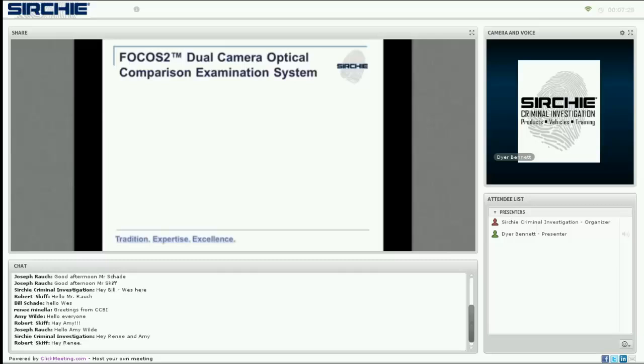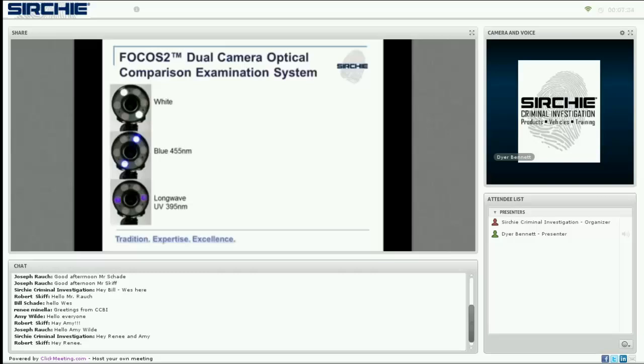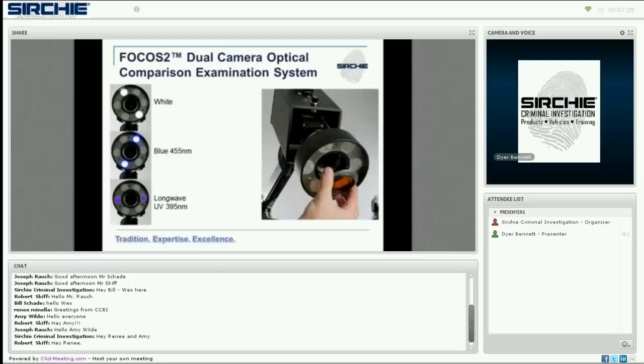Underneath the camera assembly is a bank of LED lights with white, blue, and long-wave UV. These lights can work in conjunction with included barrier filters — yellow and orange — to work with the light sources. The filters are magnetic and mount easily over the camera lens. You can flip them on and pull them right off. They store in a storage bay on the back of the camera base, so everything is included within the system, ready to use right away.